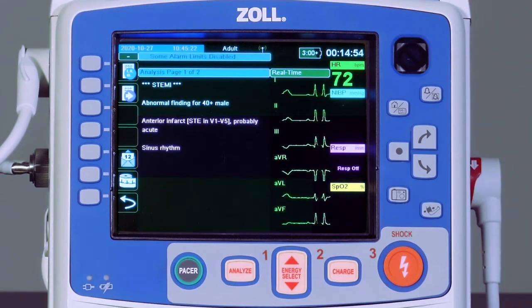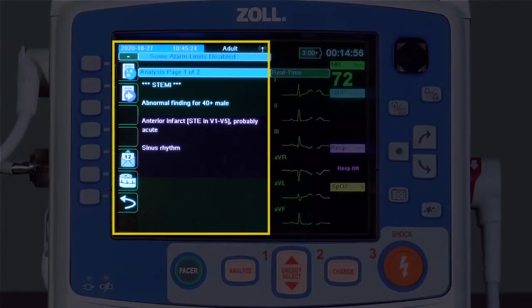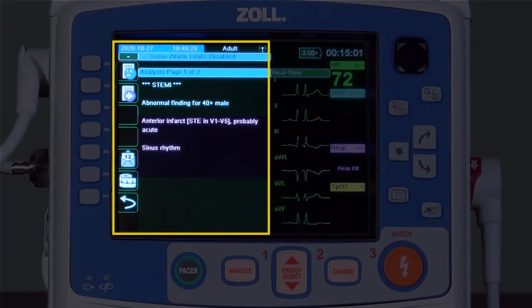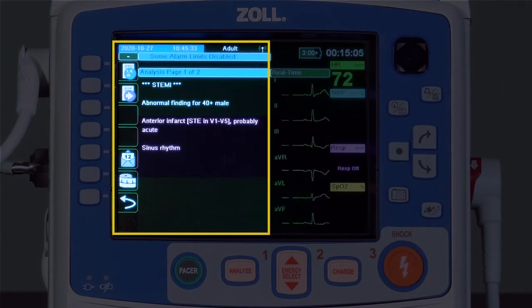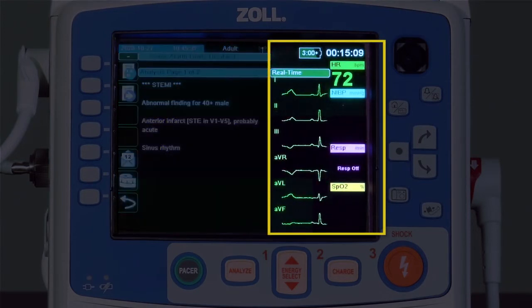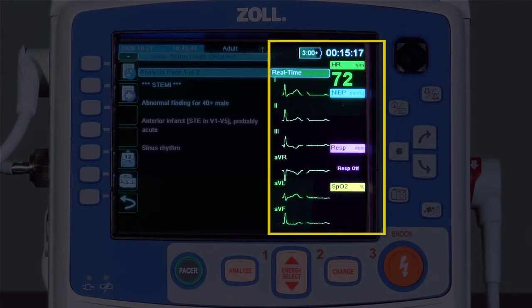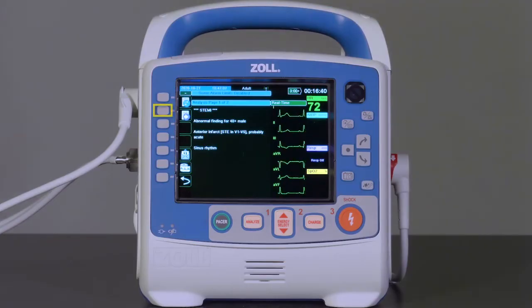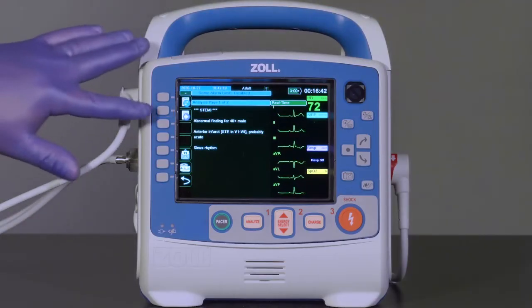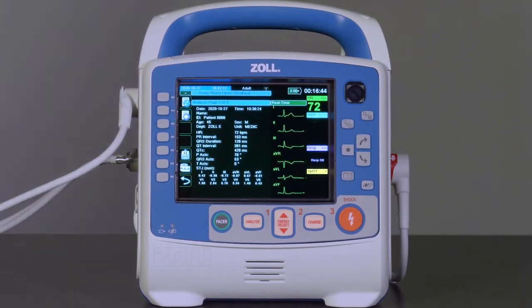The screen will be split into two views. The left is the analysis page and shows information related to the newly acquired 12-lead ECG and the Innovize Algorithms interpretive statement. The right screen is real-time view, defaulting to the live view of leads 1, 2, 3, AVR, AVL, and AVF. Press the 12-lead review next key to advance to the next analysis page.